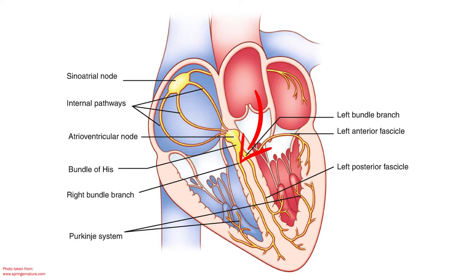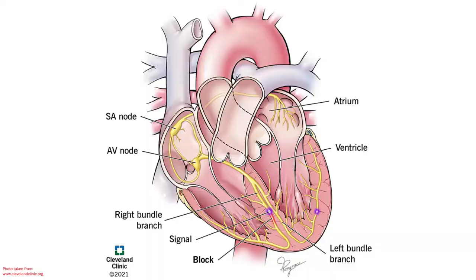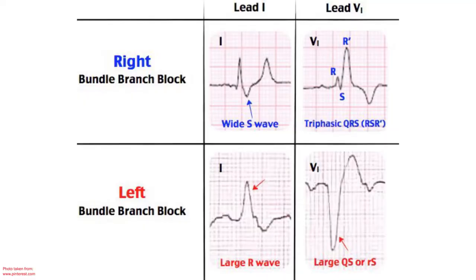Let's talk about bundle branch block. There is a bundle branch in your heart that conducts electricity through the bottom of your heart, like branches. And if there's a block in that electrical conductivity, the QRS is wider than 0.12 seconds. So you know it's supposed to be QRS, nice and tight, QRS. But if it's like QRS, no, no, no. There's a block in the electrical conductivity. There is a bundle branch block, BBB. That's how you identify that, all right?